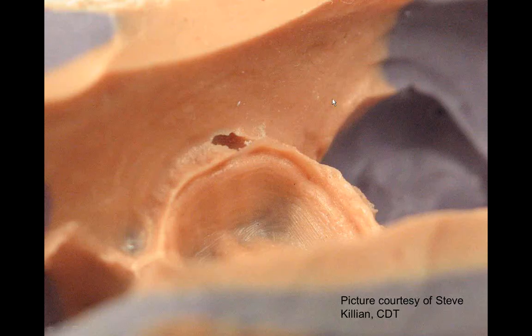All right, now here's another great one. Looks like the two materials seem to work together well. Doctor did a good job of capturing burr marks along here. It looks like we're probably going to get a decent margin, but what about that big old hole right there? This is one of those that you're going to worry about.